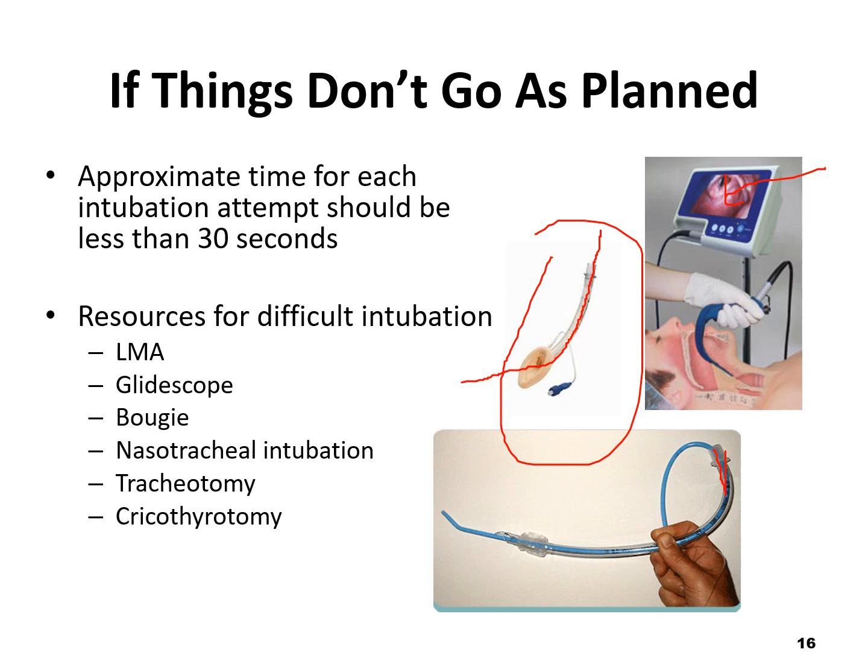A tracheostomy is making an incision through the neck, through the trachea, to assist, and you can put a trach tube in there, and that will assist with breathing when the upper airways are blocked, or you're unable to get a patient off of the ventilator.